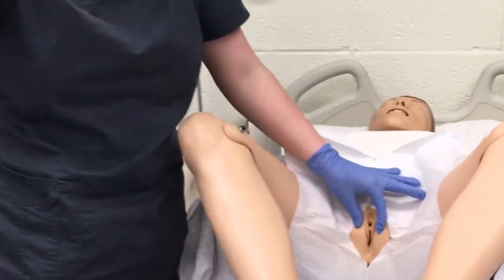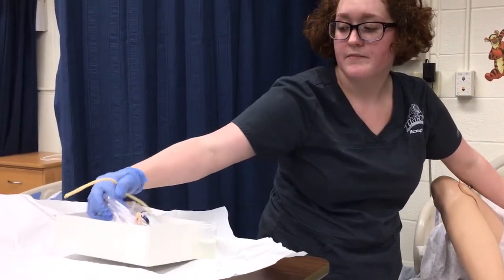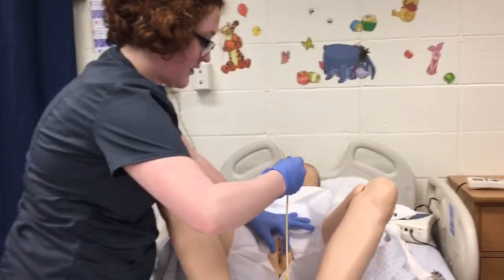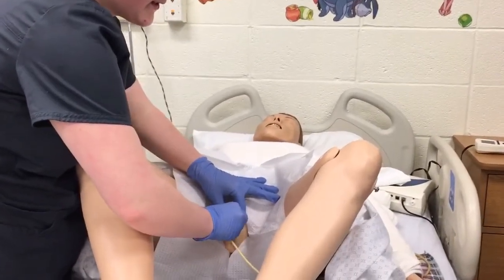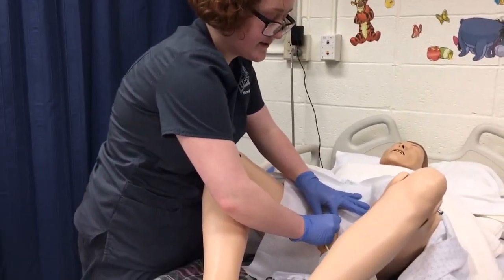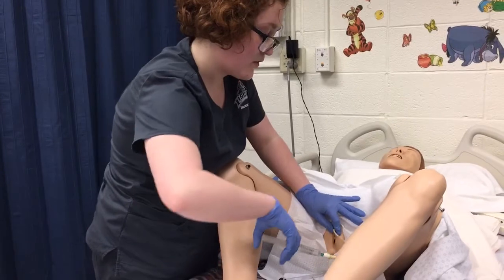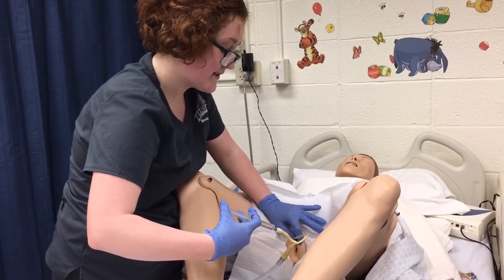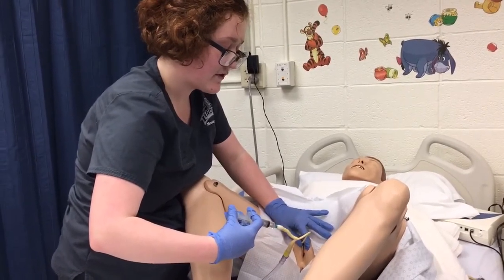I'm going to keep my hand in the same position, and then with my dominant hand, I'm going to gather everything and bring it all over at once. I am going to insert the catheter 2 to 3 inches into the female. Once I see a urine return, I'm going to insert it another 2 inches. Keeping it in place with my non-dominant hand, I'm going to use my right hand to inflate the balloon. If it meets with resistance, I know that I need to let it passively flow back out and then further insert the catheter.